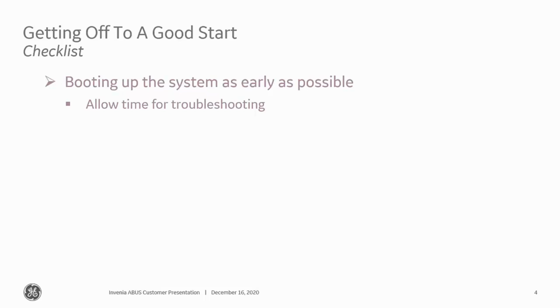It's a simple turning the system on. It only takes a quick 1 to 2 second push of the power button. And this also is the same for the shutdown process. You don't want to push and hold that power button. That would create a hard shutdown. Like I said, it's just a simple 1 to 2 second light push that will turn the system on. It takes a few seconds for it to come on, and the same when turning it off at the end of the day. It takes a few seconds for it to shut down.